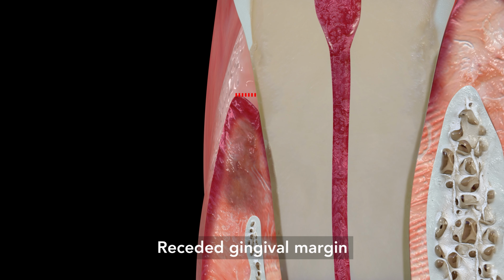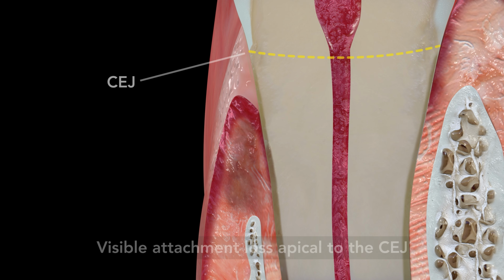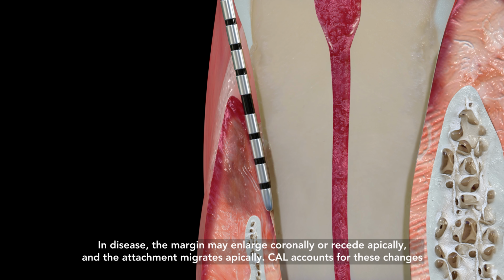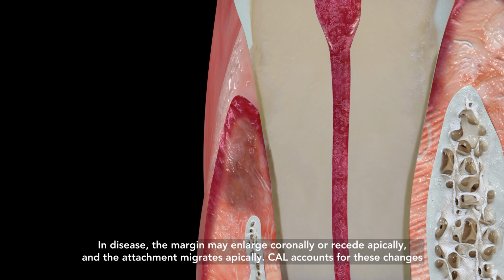Receded gingival margin. Deeper periodontal pocket. Visible attachment loss apical to the CEJ. In disease, the margin may enlarge coronally or recede apically, and the attachment migrates apically. Clinical attachment level accounts for these changes.